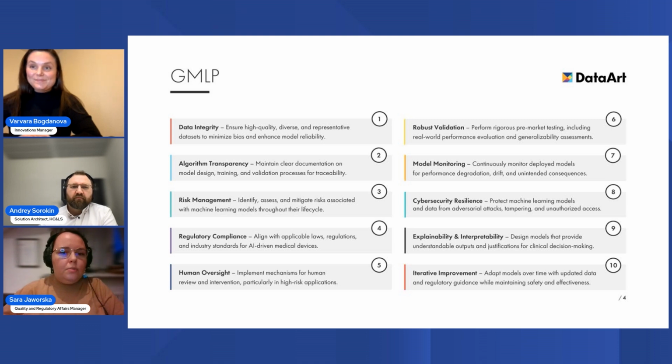In my opinion, one of the most significant roles here is human oversight. For example, the AI Act requires a stop button functionality. It doesn't have to be literally a stop button, but basically humans need to be able to shut the system down fairly easily. Another one is that training data sets must be independent of test sets. And, as already said, cybersecurity controls, implementation, and making sure the model reflects the intended use of the device.